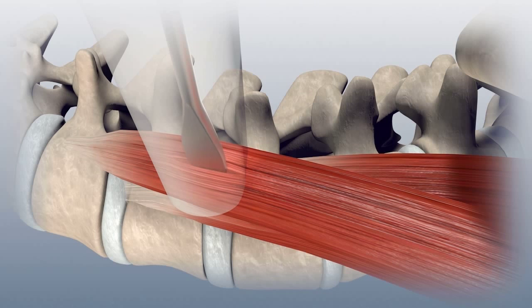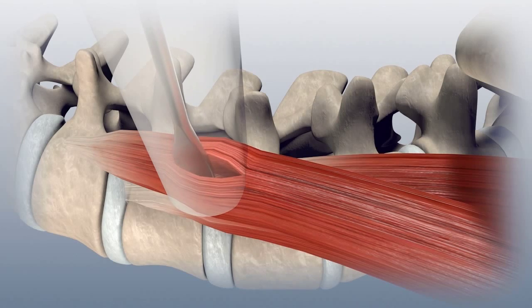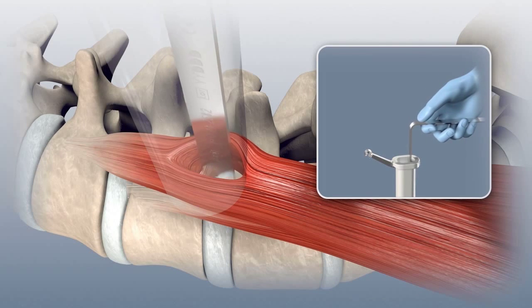Under direct visualization, gently split the psoas using a Penfield dissector or Cobb dissector, taking care to avoid the nerves. Insert a 90-degree nerve retractor through the split and retract the muscle posteriorly.